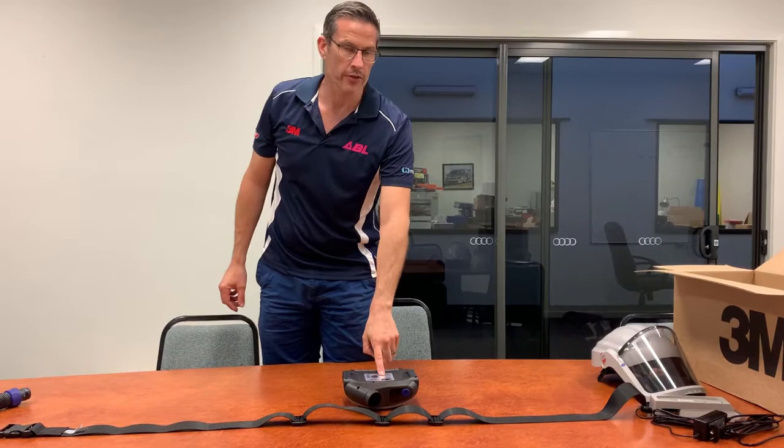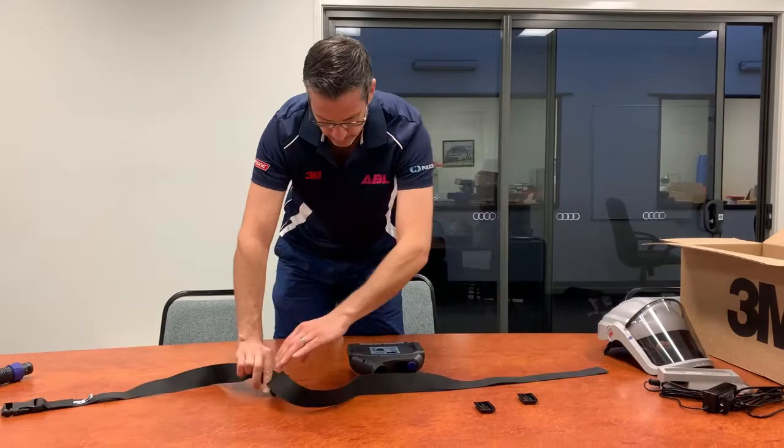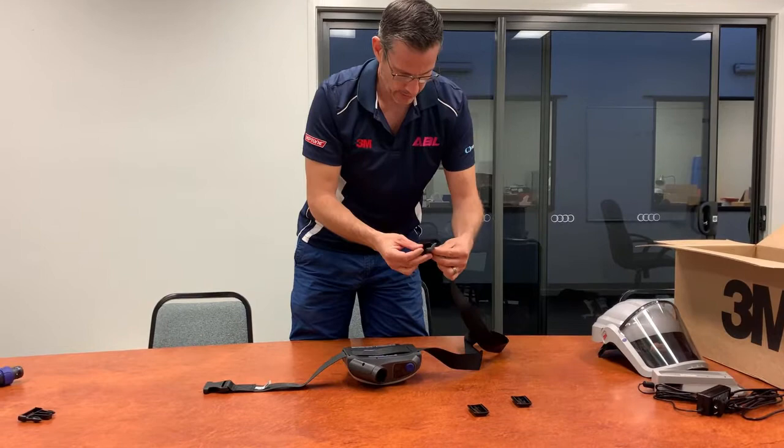Here we have a fully assembled TR-300 power unit and the belt. I'll show you how to attach the belt to the power unit. Remove all the buckles, feed the belt through the back of the power unit like so, and reattach.